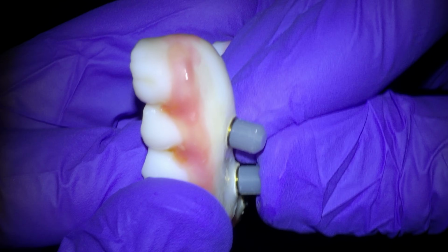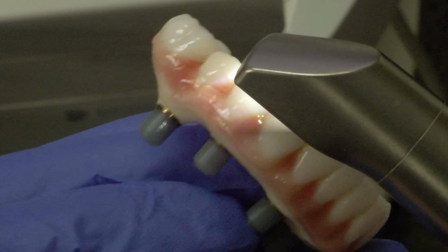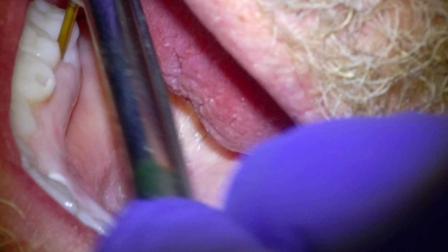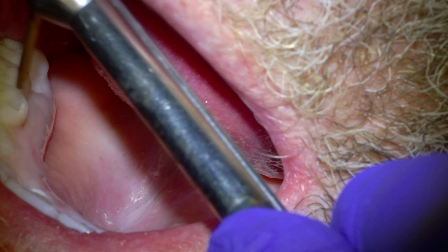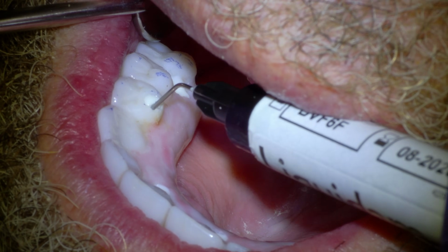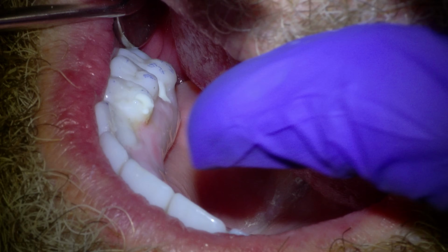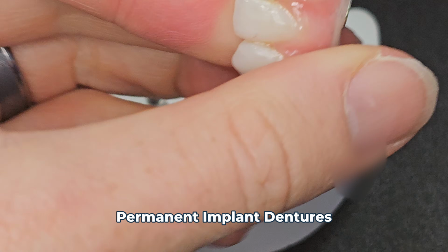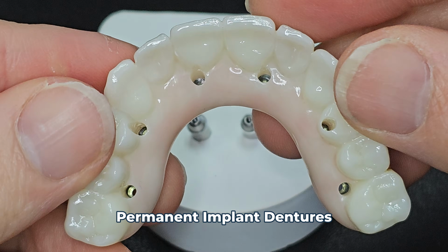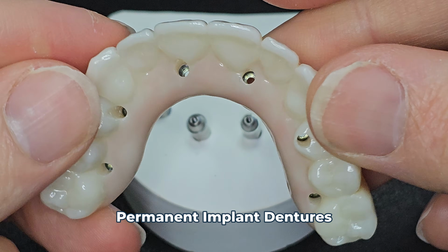And now at this appointment, after asking the patient how everything went with these, there are just a few tiny changes we're going to make, but the patient loves everything. So interesting point is, we made the teeth really white, but the patient likes how white they were. So we're only gonna back off a little bit from this whiteness because frankly, it's really white. After all the scans and prosthesis are back in place, the lab starts making the final prosthesis. And so let's go to that.